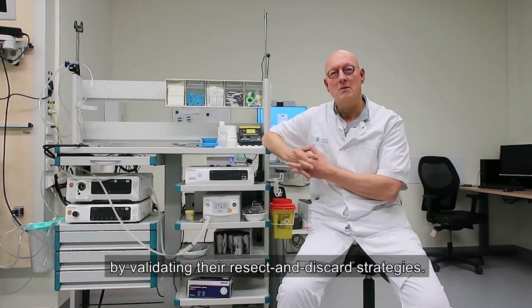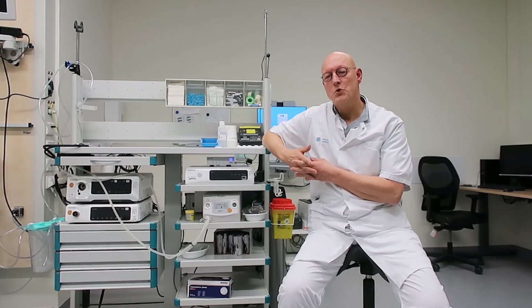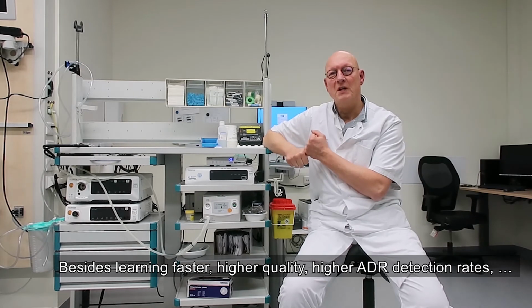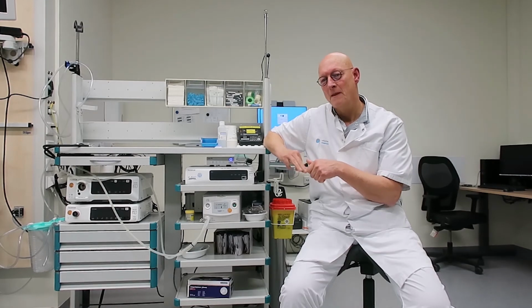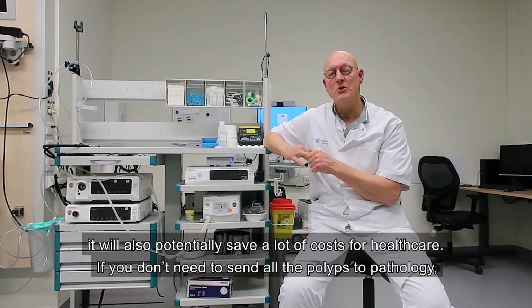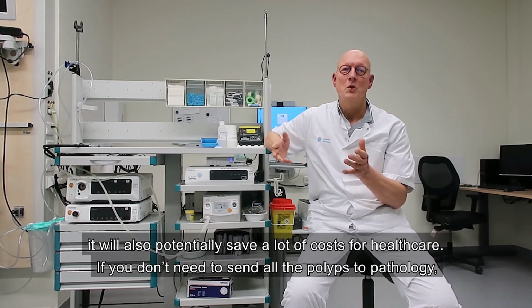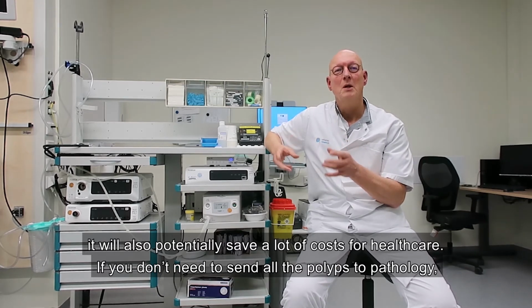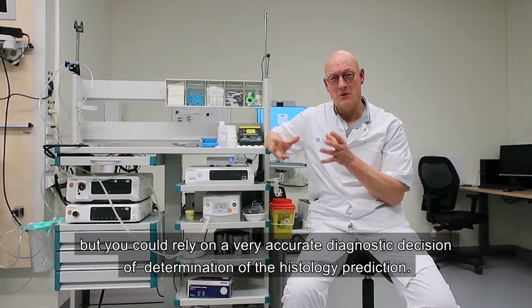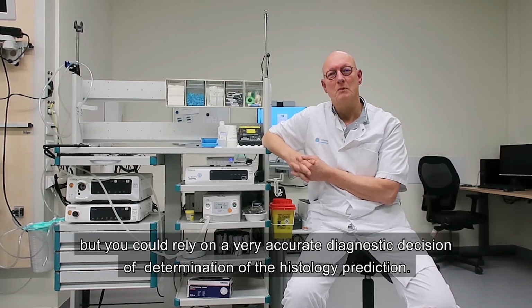by validating the resect and discard strategies. So besides learning faster, higher quality, higher ADR, it can also potentially save a lot of costs for healthcare if you don't need to send all the polyps to pathology, but you can rely on a very accurate diagnostic decision of determination of the histology prediction.